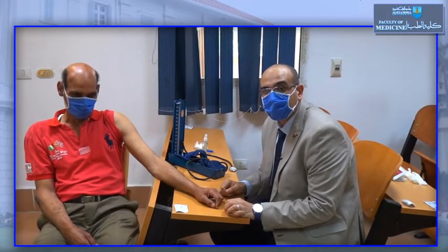Good morning. I'm Dr. Muhammad Mamdouh, lecturer of nephrology and internal medicine. Now we are going to do clinical examination for vital signs. We will start by blood pressure measurement. As we described before, for the measurement of blood pressure, the patient should be positioned correctly. His back should be supported, both his arm and his legs. At first, you should introduce yourself to the patient, of course.